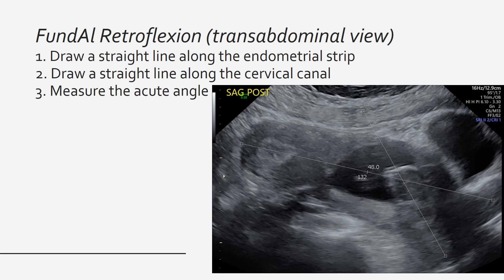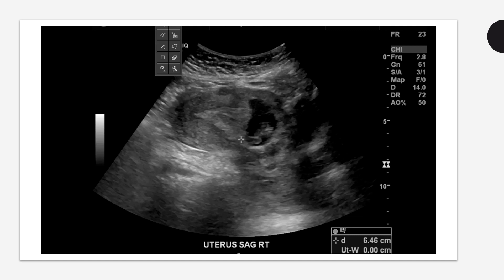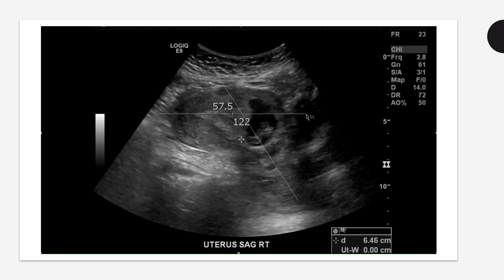The third marker is the presence of an acute far angle, or the fundal retroflexion angle. This is obtained on the transabdominal view, zoomed out with the fundus and the cervix in the same frame. First, draw a straight line along the endometrial stripe. Second, draw a straight line along the cervical canal. Then measure the acute angle that is created. In this scan of a cesarean scar ectopic pregnancy, the acute angle is 48 degrees. This is a cine clip showing the far angle being measured post-production on our PAC system using the angle measure function. In this scan, the acute angle is 57.5 degrees.